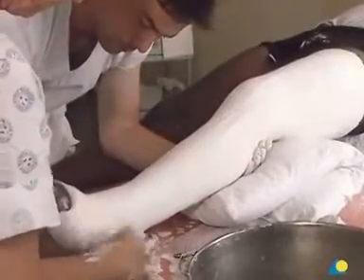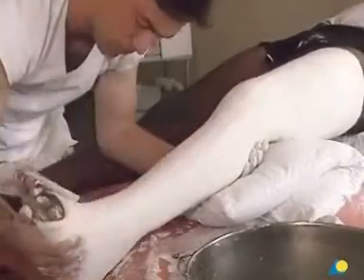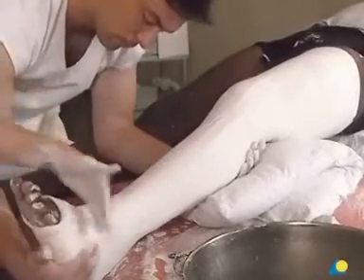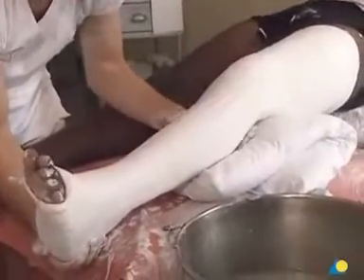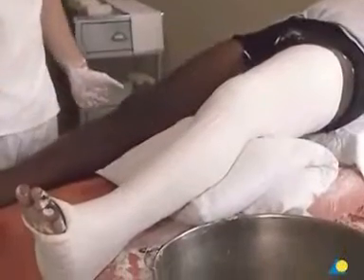The pressure should be continued until the plaster sets. However, the plaster will not reach full strength for 36 hours. The foot should be kept elevated when possible to prevent additional swelling. The exercises for the patient may now be explained and demonstrated; they include flexing the toes and lifting the leg. The application of the upper leg circular cast is now complete.